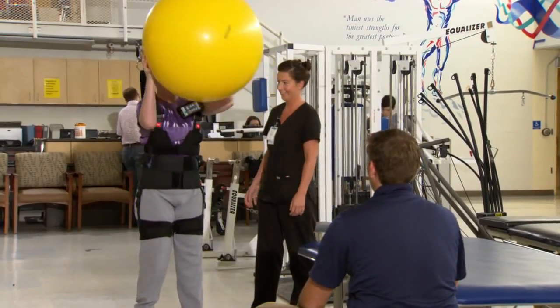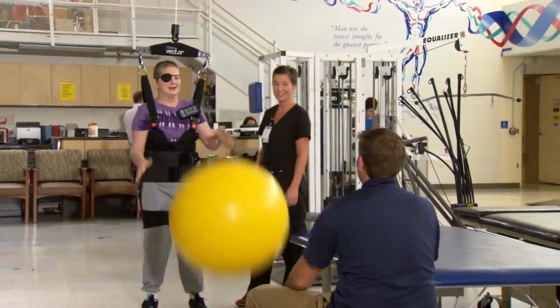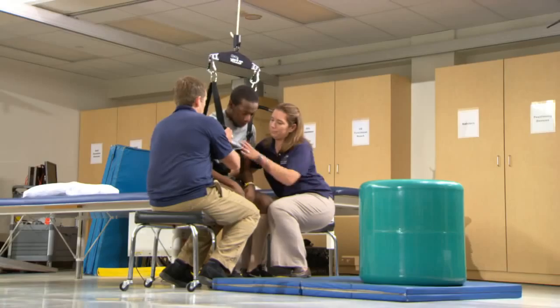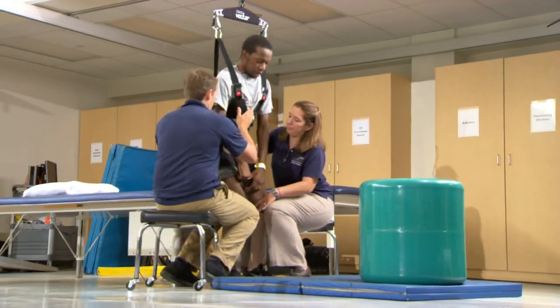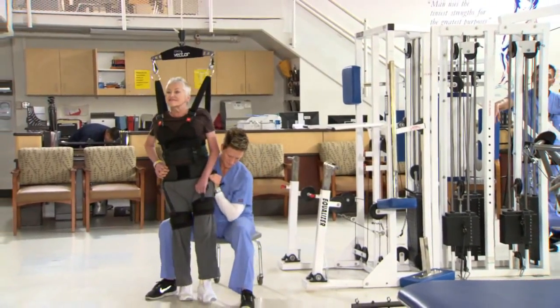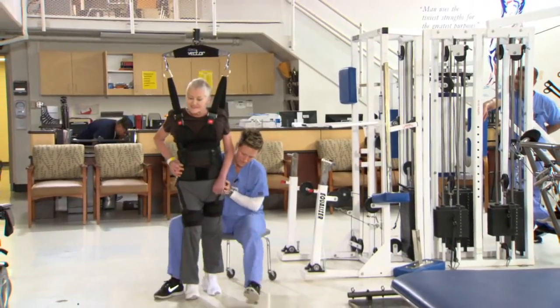I really like the idea of allowing them to learn their own strategies, or relearn their own strategies, to their balance, to come up to a sit to stand without me having to help them. I think it adds a level of personal satisfaction as well when they start realizing they're able to do more of this on their own with a little less help from the therapist. I think that's one of the biggest things that we've been able to do.